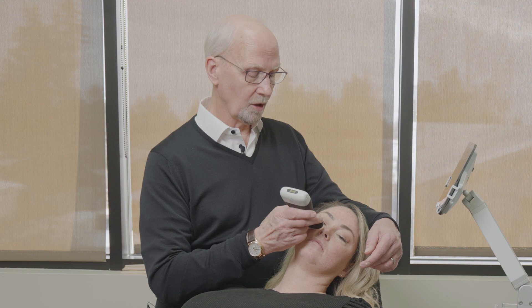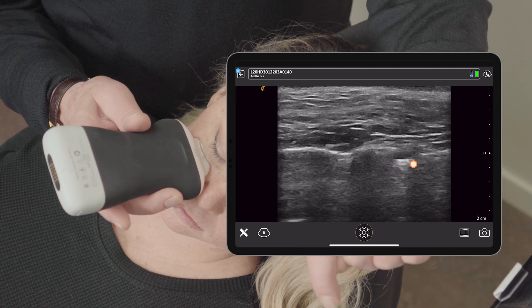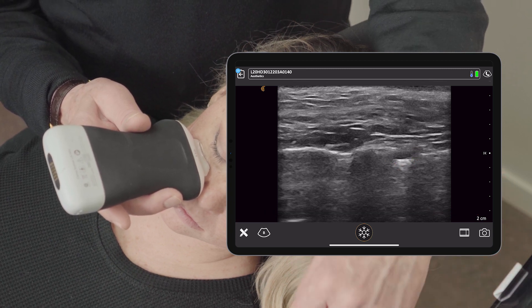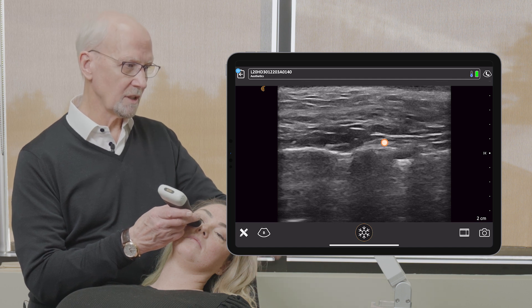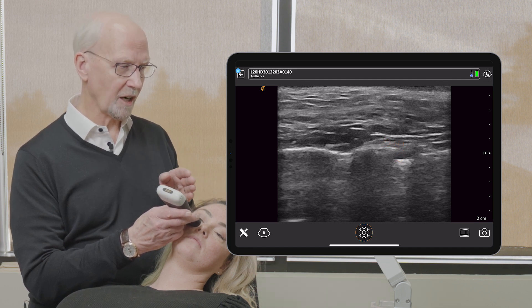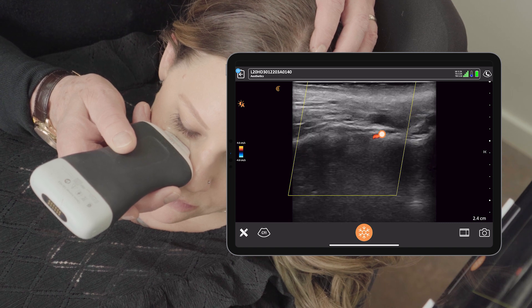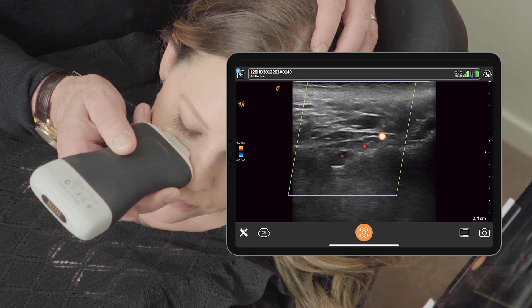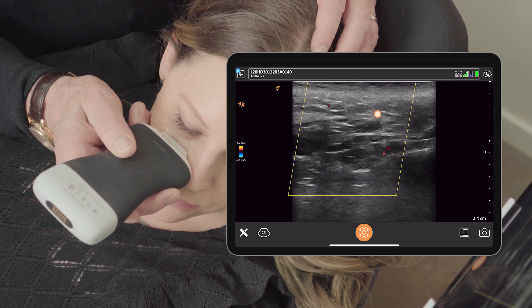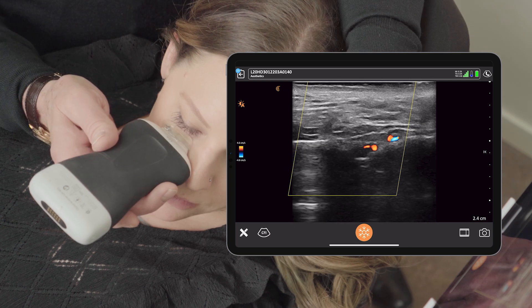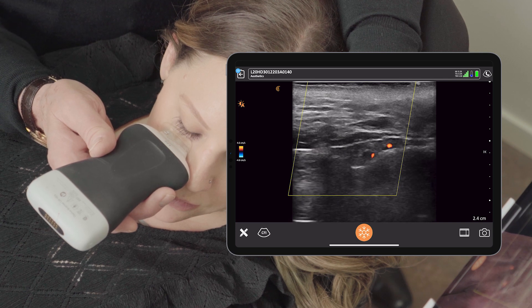We're now going to come up and look for the infraorbital foramen. And here's the infraorbital foramen — we'll see this increased density of our image, more echoes coming back to it, with a little bit of reverberation and mirroring. We'll also see this little hook on the side, which is helpful when we're injecting from the lateral aspect towards the medial aspect, as it actually protects the area. Here we have the infraorbital foramen and the infraorbital artery pulsing out of it, and just superior to that we have the facial vein, which is very easy to compress and lose.